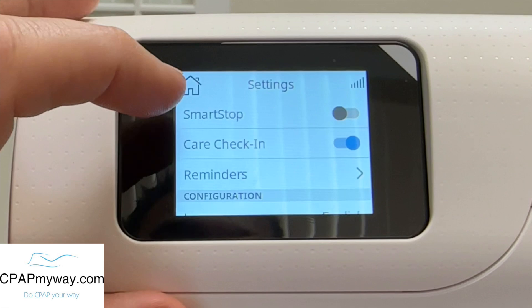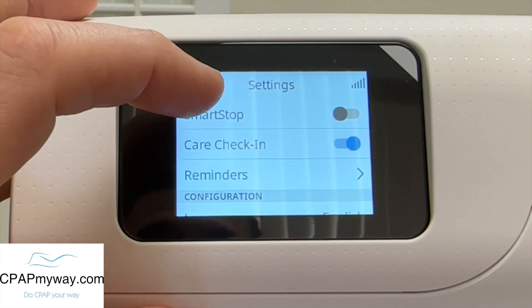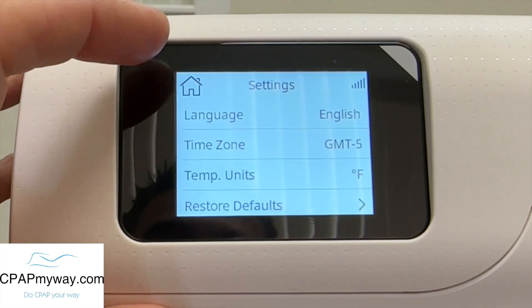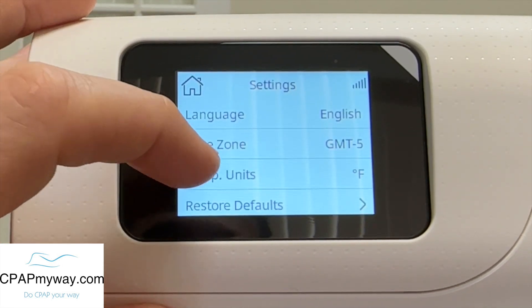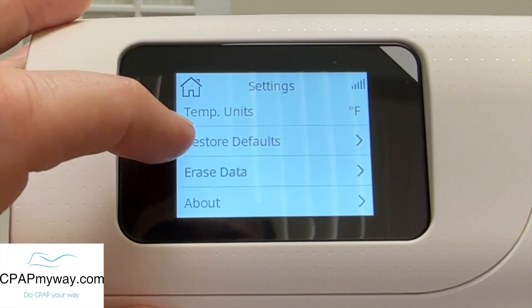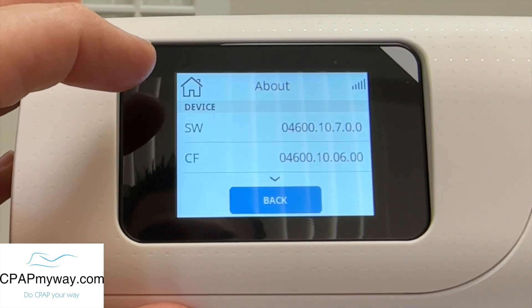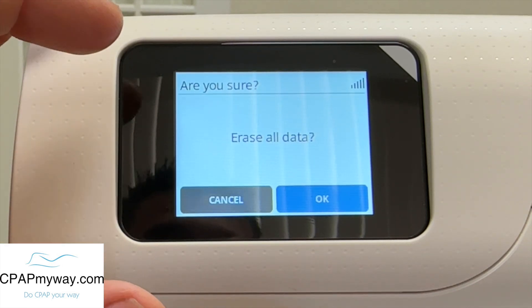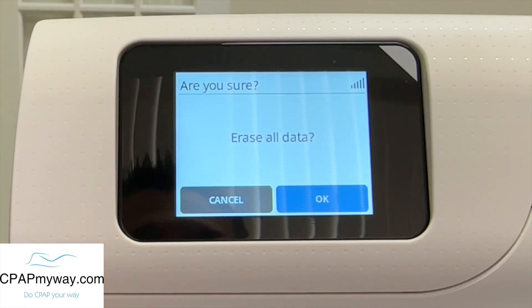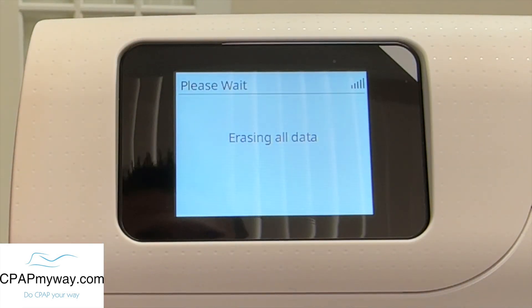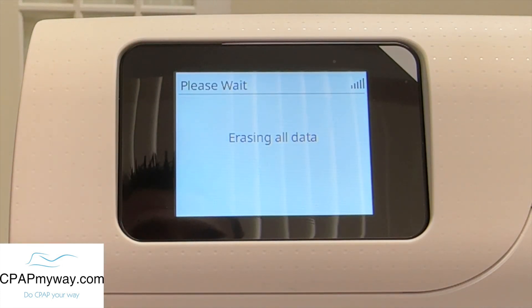Care check-in is the new feature available on AirSense 11 — it helps give good information to the patient based on their data to help them adjust to the machine. Language, English; time zone; temperature — you can jump to Celsius if you wanted to. And then we did demo the restore defaults. Erase data: if you want to completely reset this device and have it ready from one patient to another, maybe it was a rental and it came back in, you would erase all data and it will erase all of the compliance and therapy data from the previous user and allow you to put it out on a new user.